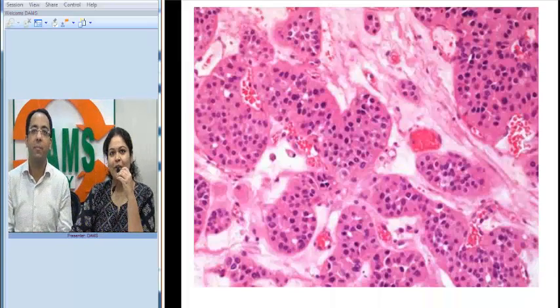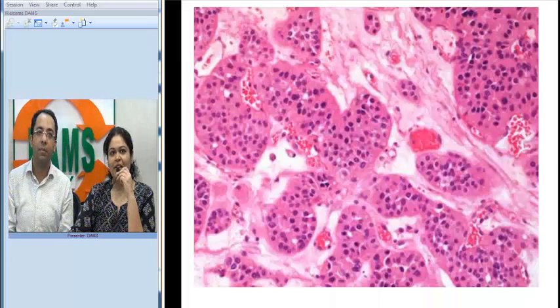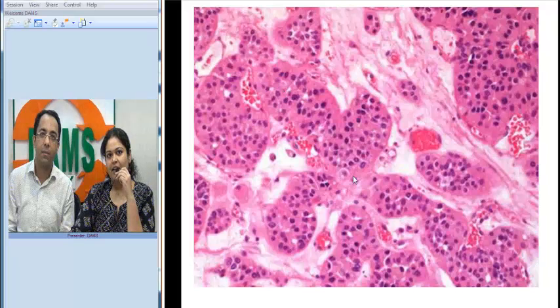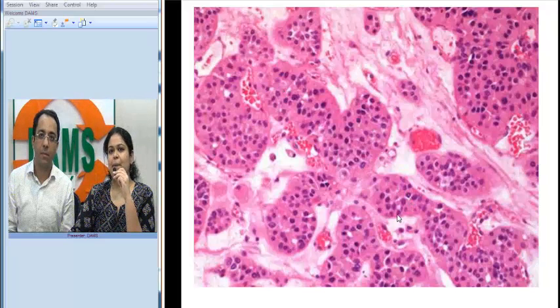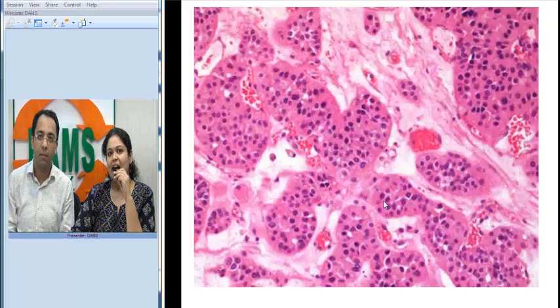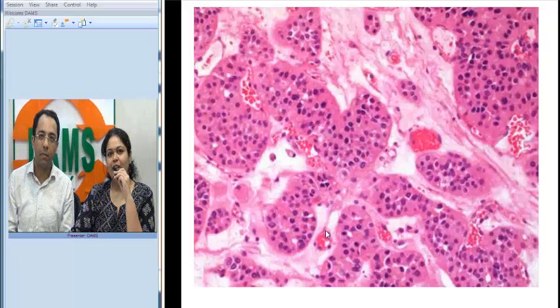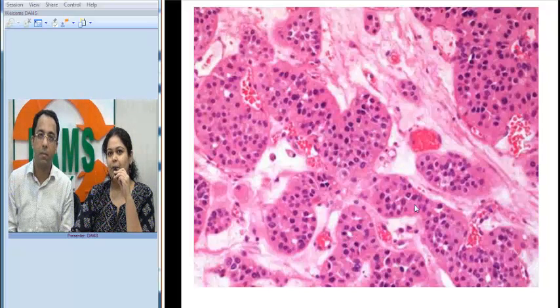On microscopy, we see nests of cells with bright pink cytoplasm. The nuclei are predominantly uniform with very fine chromatin, round nuclei, and not much atypia.